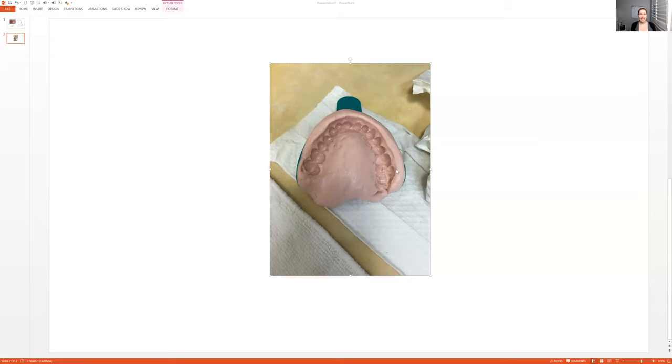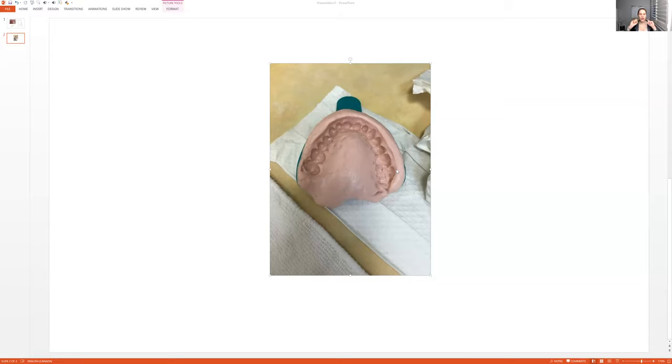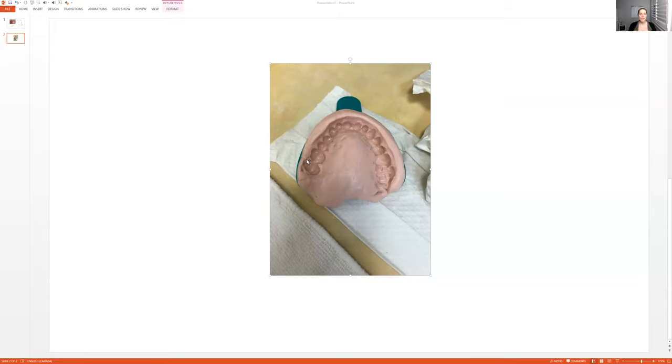So what I do to break the suction is I go at the back and, how can I explain this? I just kind of move the tray down. So I put my fingers, like picture this being at the back. So I put my fingers along here and then I push down. So like this, usually I do one side at a time because if you do one side, it kind of loosens up the other side too, but everybody's different.